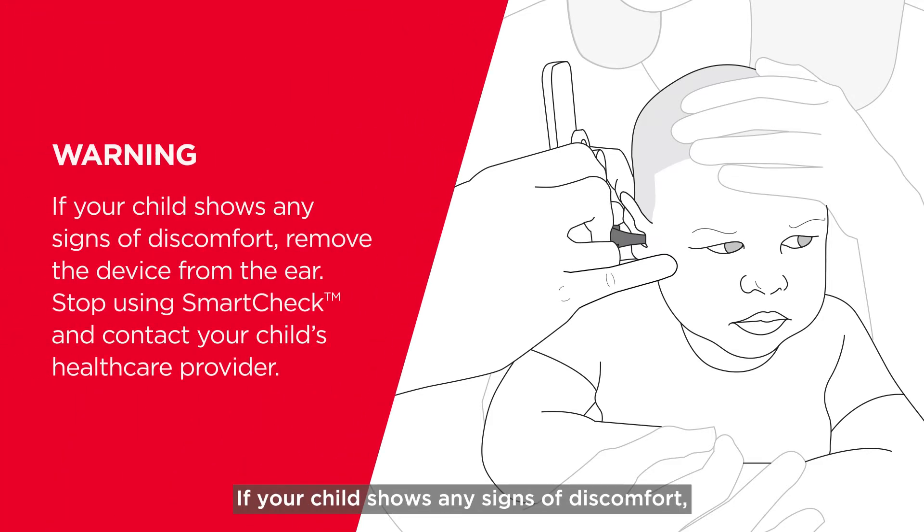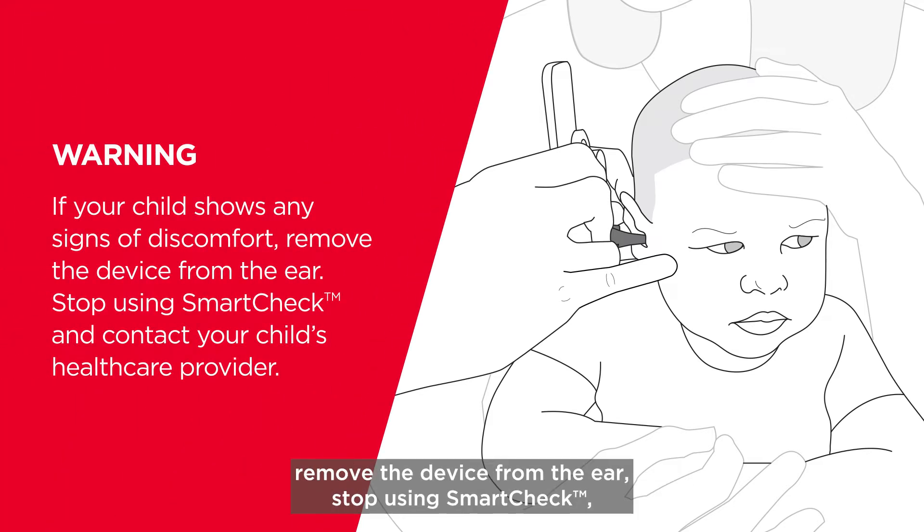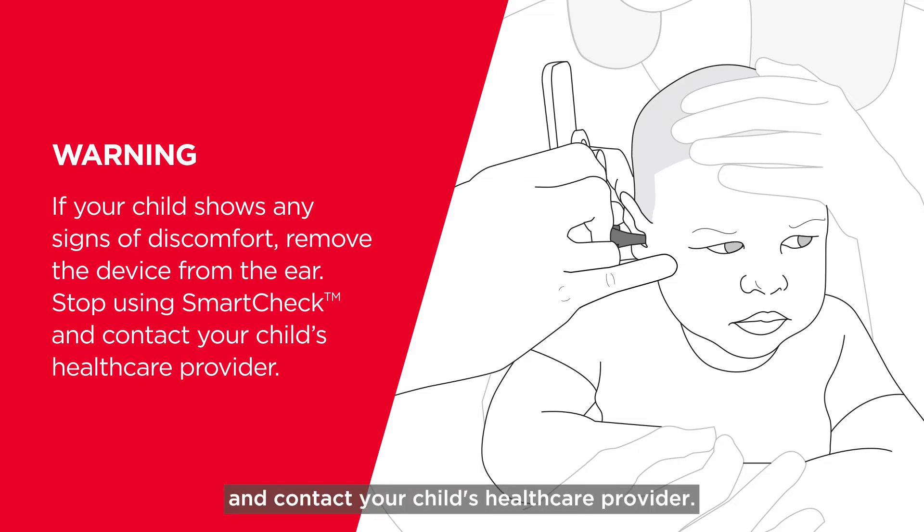If your child shows any signs of discomfort, remove the device from the ear, stop using SmartCheck and contact your child's health care provider.